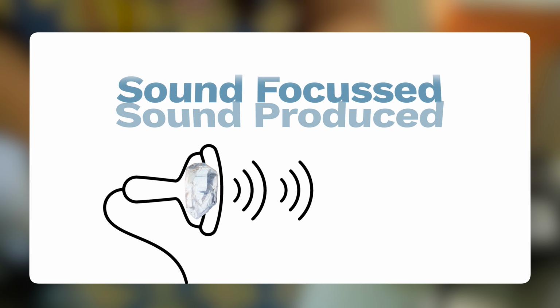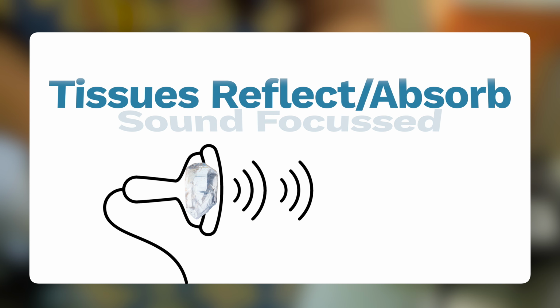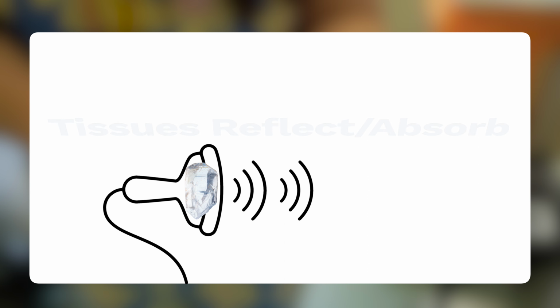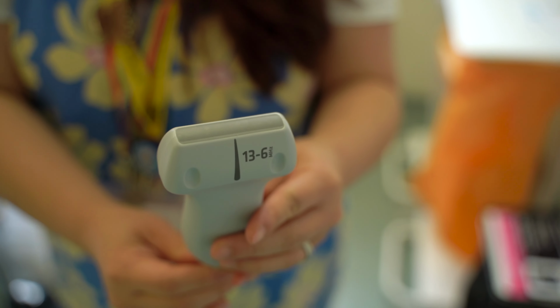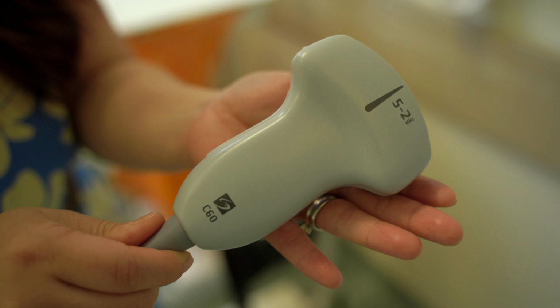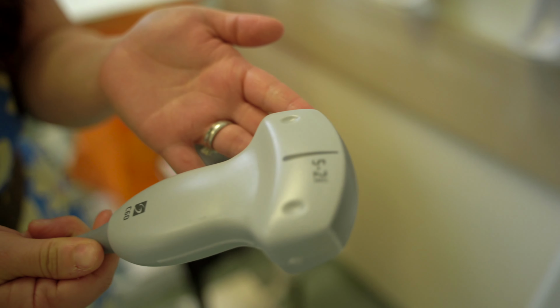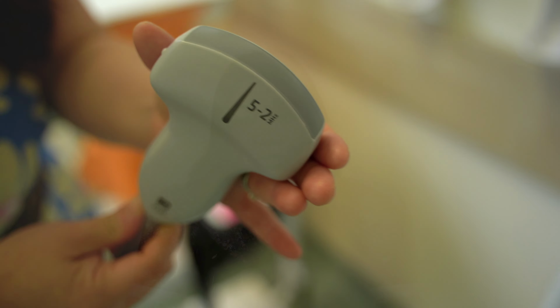The sound from the probe can then be focused by special lenses into a beam, and that goes into the patient's tissues. The shape and the penetration of this beam is determined by the lens or the shape of the ultrasound probe. You'll have seen the common linear probes that produce a square image on the screen, and also the curvilinear ones that produce a fan-shaped image, and those are the ones that you'll have seen for things like gallbladder, kidney, and also for pregnancy ultrasounds.